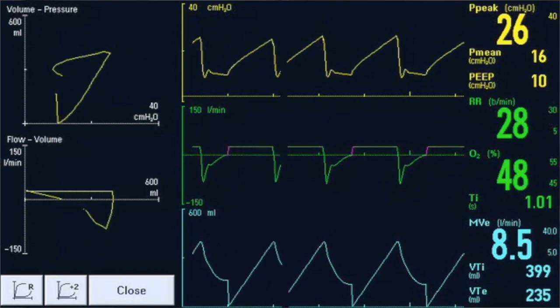But in reality, when you leak, it is measured in mLs. You measure the leak not only in percent, comparing the set tidal volume versus the exhaled tidal volume, but also you want to determine how many mLs am I leaking? If I have a set tidal volume of 420, am I getting back those 420?